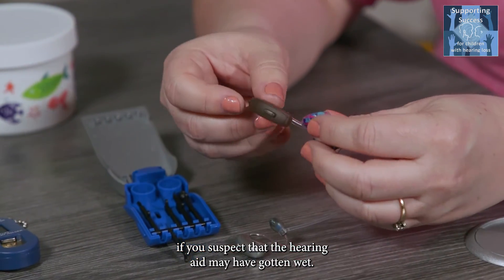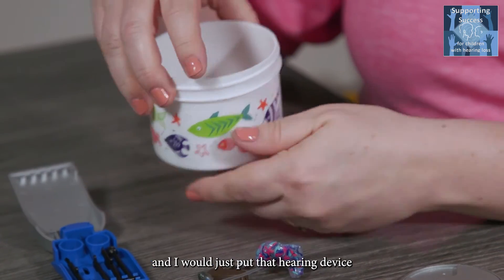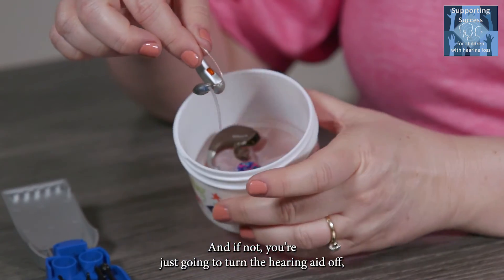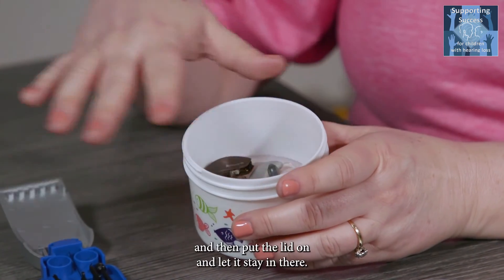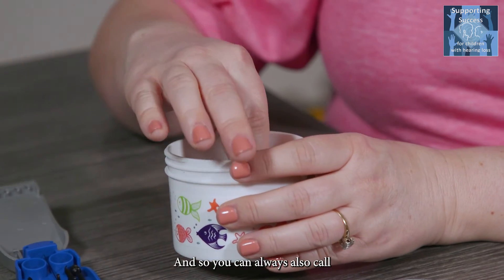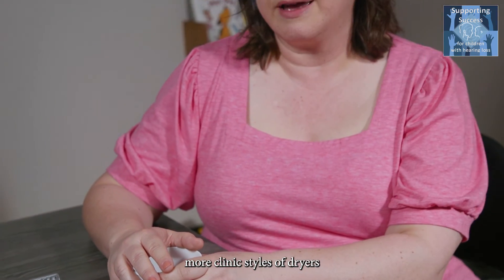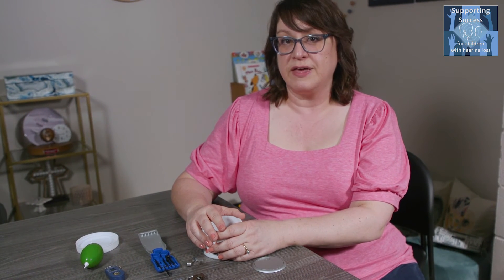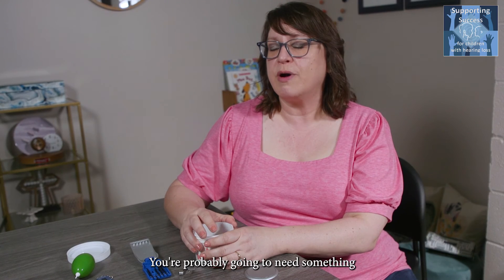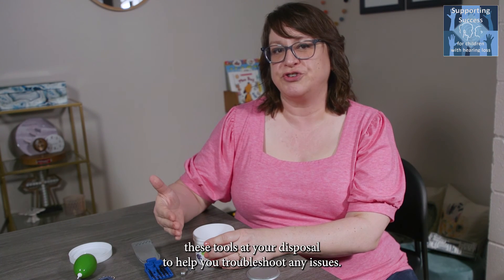If you suspect the hearing aid has gotten wet, use the drying jar and place the hearing device in there with the battery door open if it has one. If it's rechargeable, turn it off and lay it inside, then put the lid on and let it sit for at least five hours or longer. You can also call your hearing clinic — they often have more powerful clinic-style dryers that are more effective, especially if the aid has been run through the washing machine or worn into a pool. Just know you have these tools at your disposal to help troubleshoot any issues.